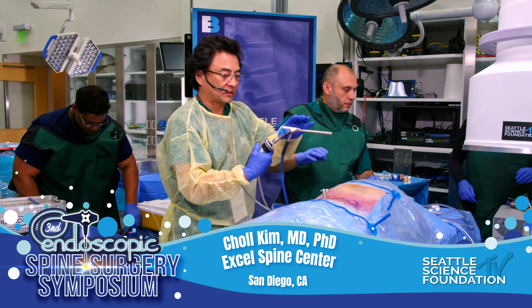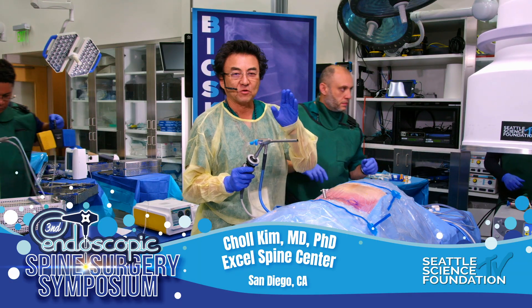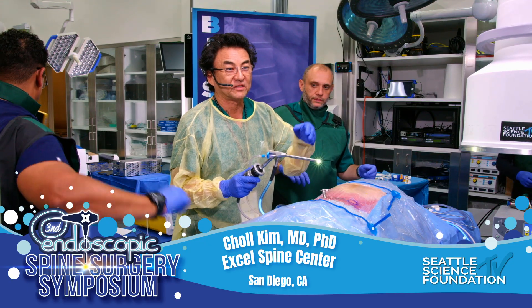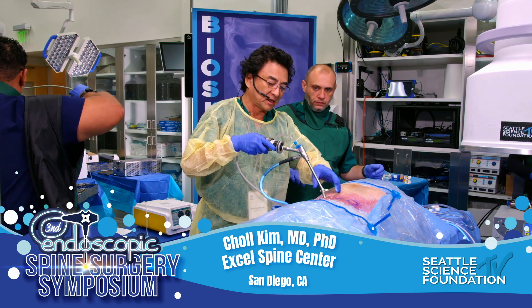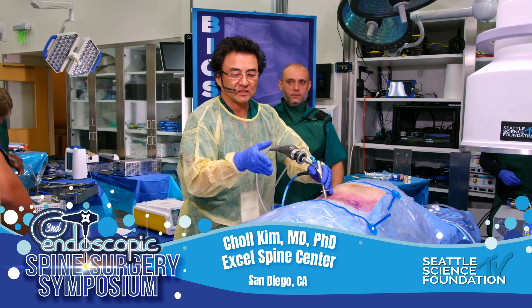I've been instructed to demonstrate the utility of the bone scalpel, bone blade. I call it 'endosonic' because it rolls off the tongue much easier, and it's essentially very similar to the open systems that are out there.